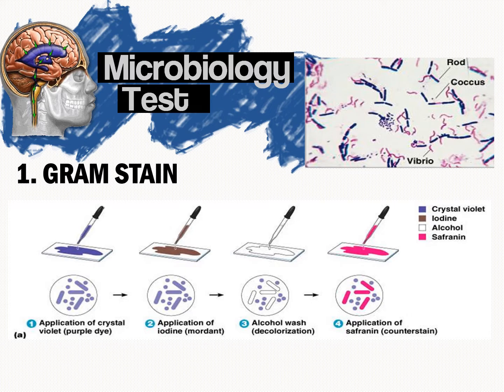Gram stain is one of the tests performed in the microbiology department. This is routinely performed on CSF specimens from all suspected cases of meningitis. Take note that failure to isolate organisms on smear should not be interpreted to mean that organisms are absent. For bacteria to be seen on a Gram stain, there should be at least about 100,000 bacteria per mL, and less than this could mean a false negative result.